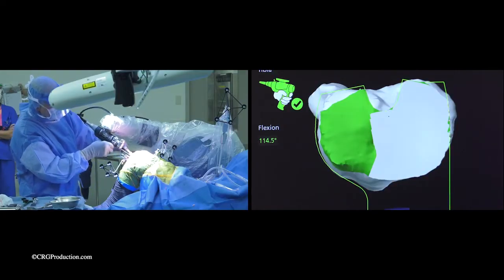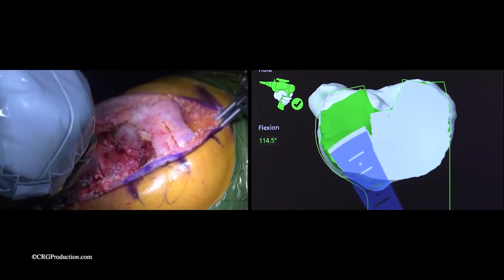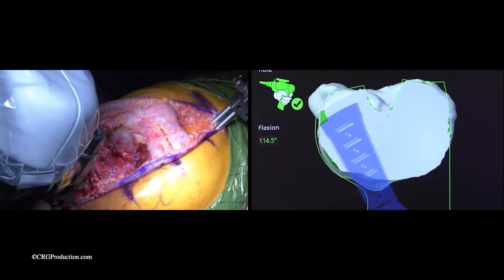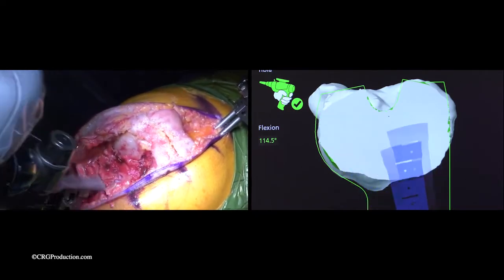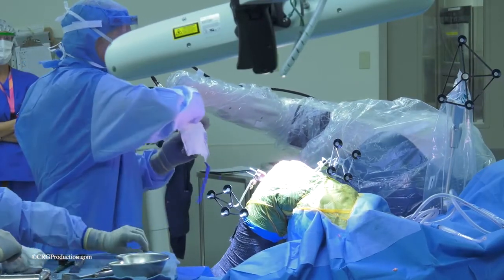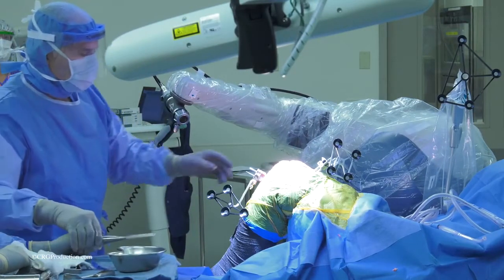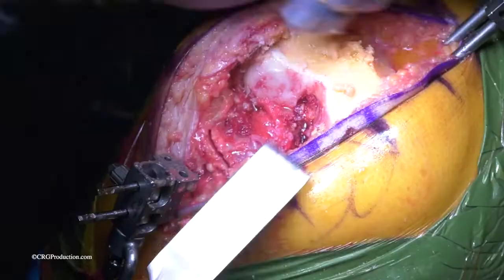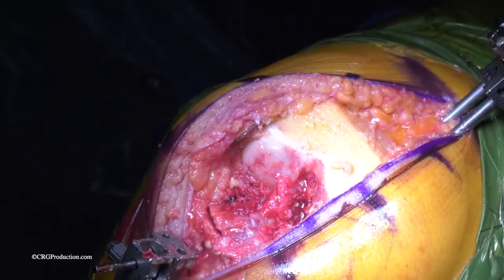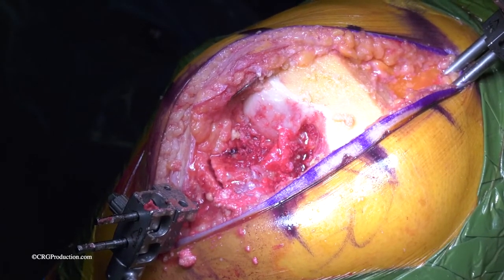It can be a tight fit. Sometimes it takes a couple seconds to get it in the right position. Once we get it in a good position, we can just simply proceed with the resection. At this point, the saw blade has to be changed from a head-on position to cutting the bone at 90 degrees. So the bone resections are now removed while the saw blade is being prepared. We can see the nice clean surfaces of the bone resection noted.